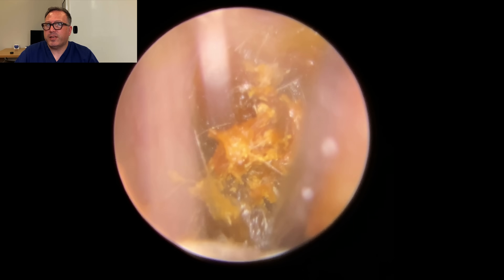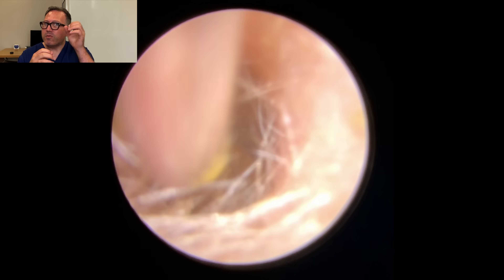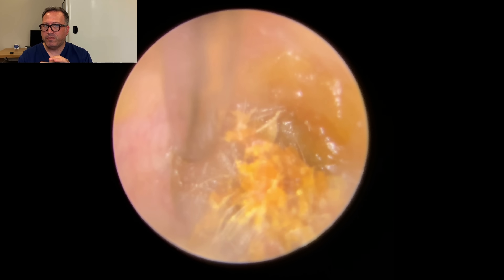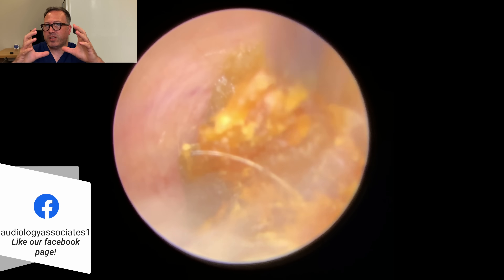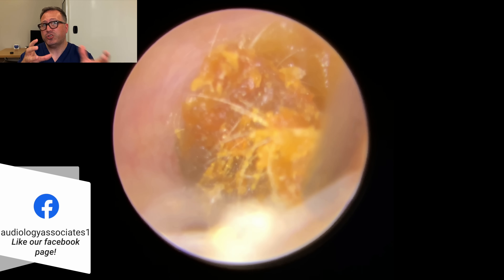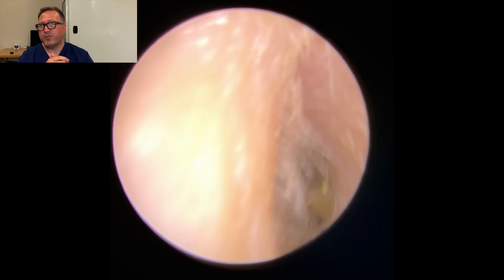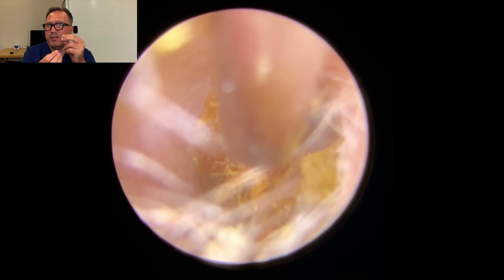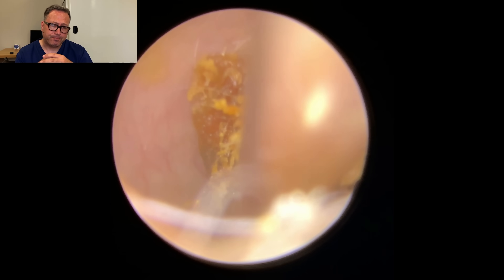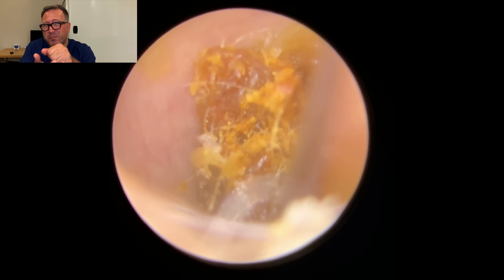You can see we've managed to peel the left side, just lifting off the bottom of the canal. Remember with the fine end, you don't get a tremendous amount of suction grip because it's a much smaller surface area — you don't get that nice wide grip and steady hold on the wax. So the fine end is great for this kind of detaching and lifting up off the canal wall, but not quite so good for getting a good grip and pulling large pieces down.